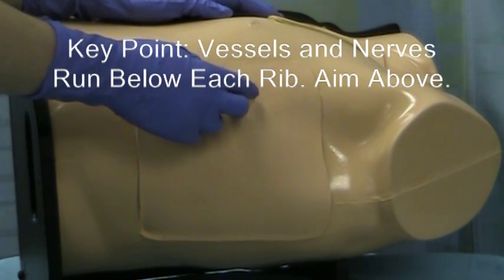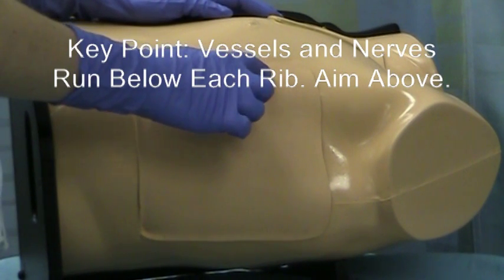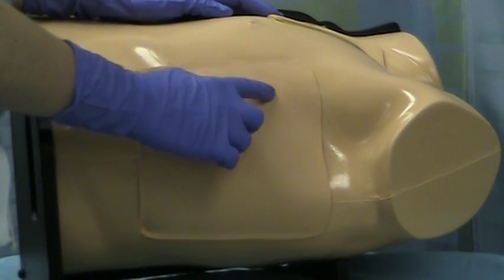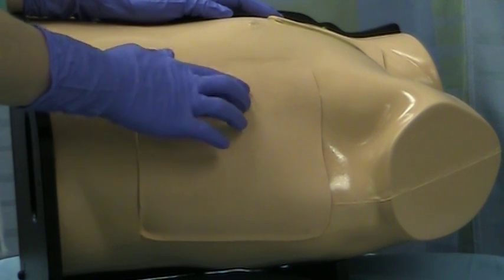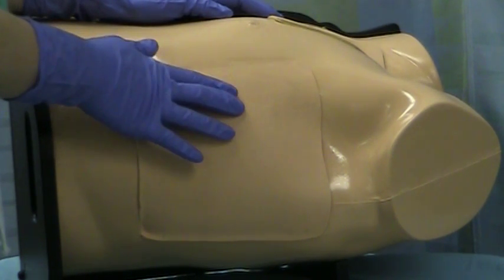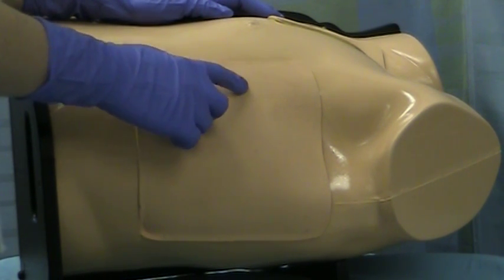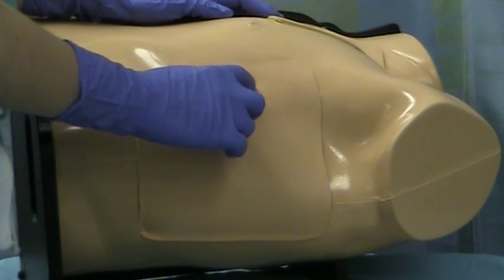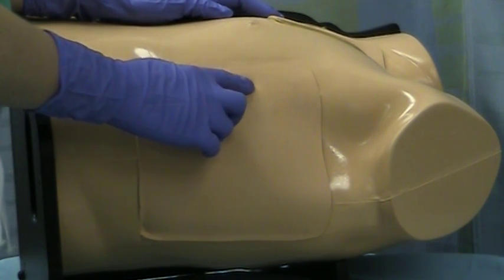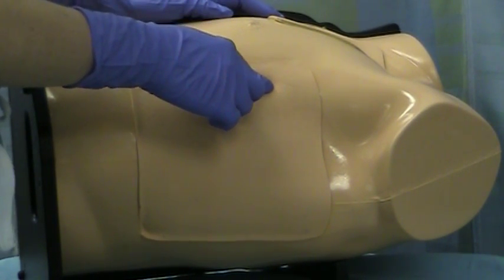Okay? The other things we make sure we avoid are the fact that we have arteries, veins, and nerves that underlie each rib. And so when placing a chest tube, we make sure that we go over the rib as opposed to underneath it. In order to maintain a good seal in our chest tube, we generally make an incision along the top of our rib. This also gives us some support for the knife, and then use our clamp to tunnel over the rib and into the chest cavity.